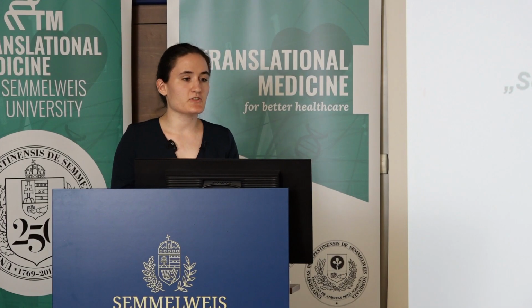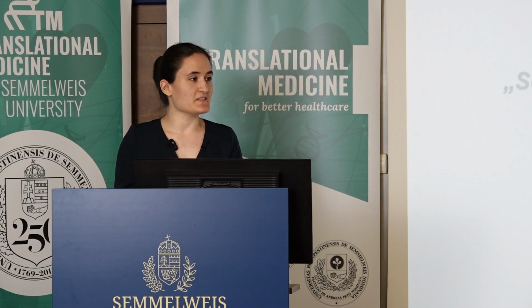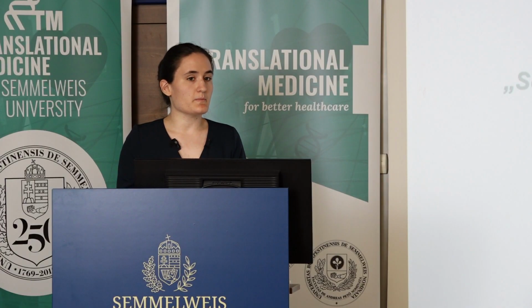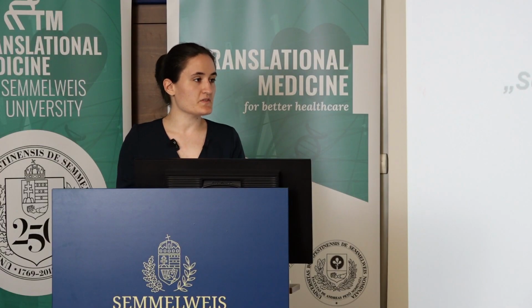Thank you very much for the question. Even in our clinic, I think the freehand method is the most widespread right now. They started using static guidance too, so I think it appears more often. I also heard about the dynamic navigation system, but the main problem here is the financial side, as dynamic systems are relatively high in cost.